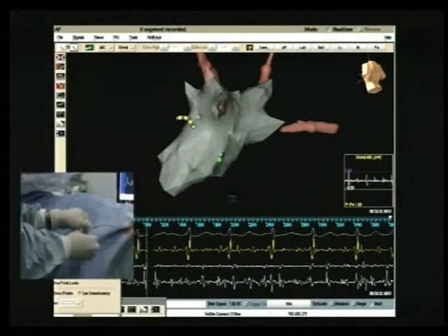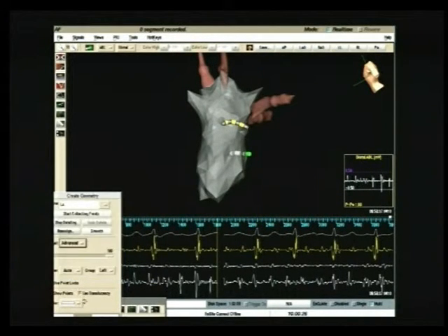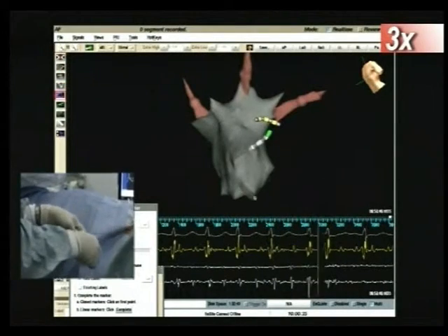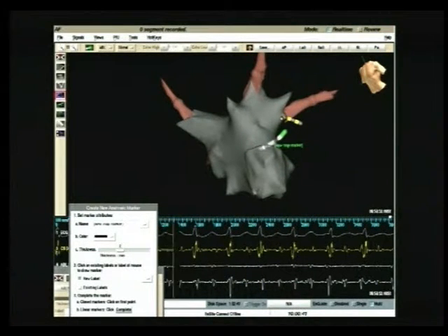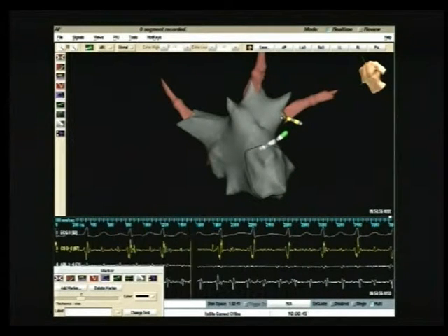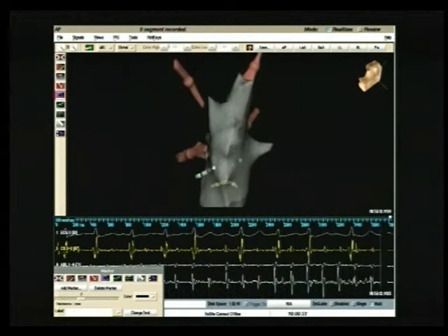While the operator refines the map, the nurse checks for the ACT before ablation starts. When the left atrial geometry is accurately reconstructed, the anatomic marker icon is opened in order to delineate the perimeter of the mitral valve using the red arrow shown on the screen. Next, the valve surface is cut out. The same procedure is then repeated for the transeptal puncture area.